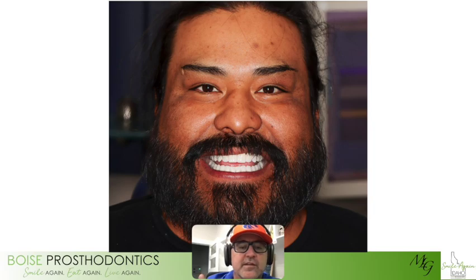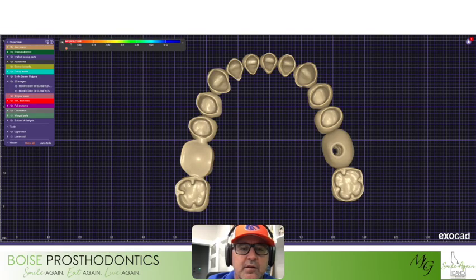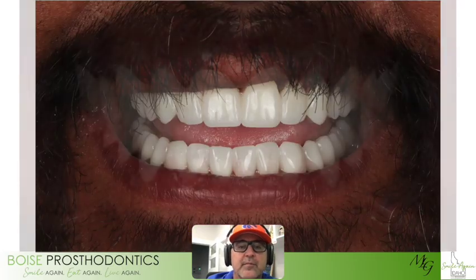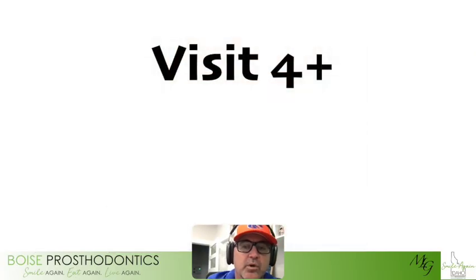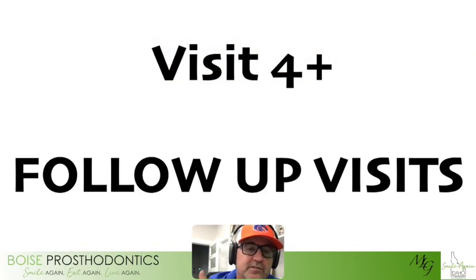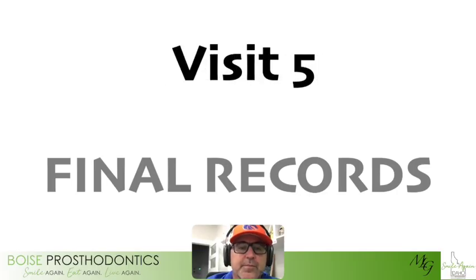And thus, you'll see that tooth was out. Let's go back here. On that lower right side, the tooth was out, so we made a little bridge while that area healed. And because we could move forward quicker and he wanted to complete his ceramic teeth without that implant crown being done, we proceeded to what we call visit 4. 4 plus is just all the follow-up visits. Visit 5 would be our final records.